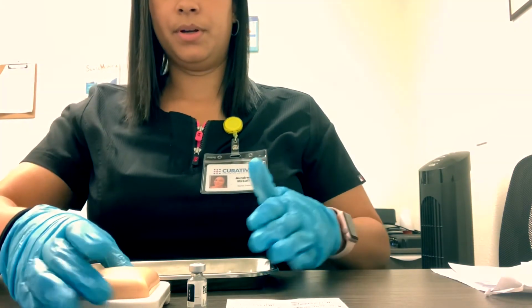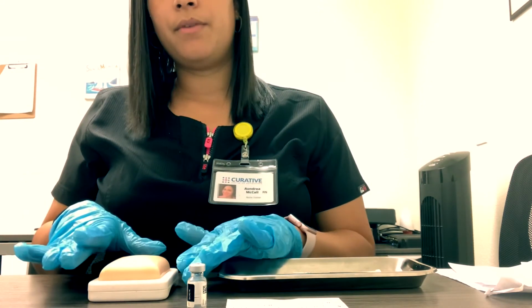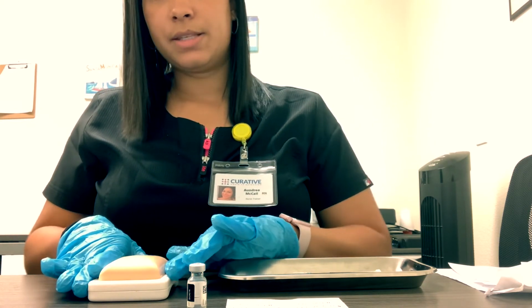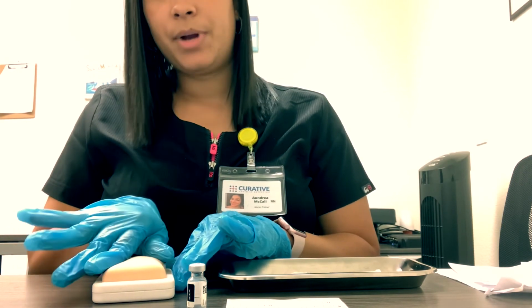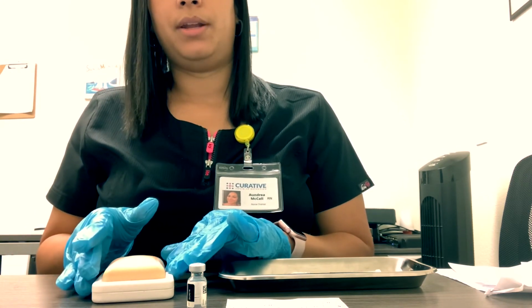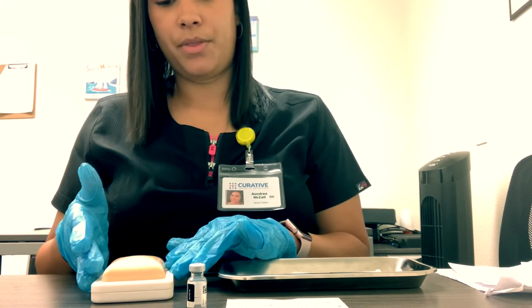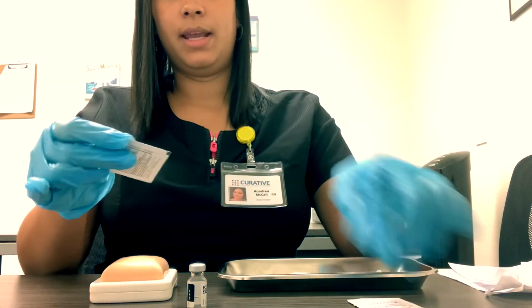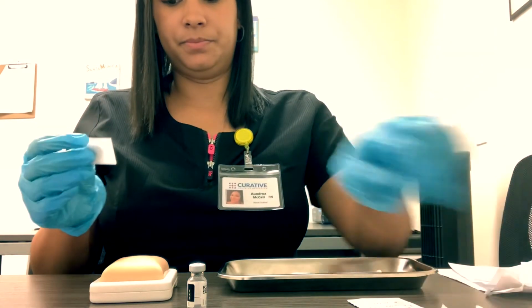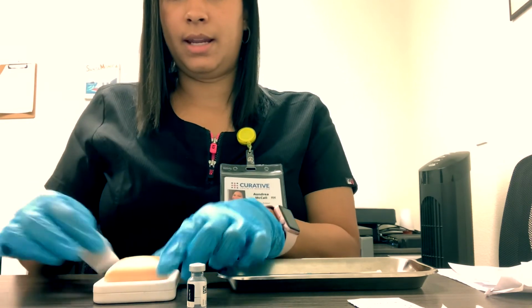Now we're going to go ahead and prepare to vaccinate our patients. And when we are vaccinating our patients, you guys need to use your best nursing judgment as to which technique you're going to use, whether it's the Z-track, whether you're going to pinch or you're going to spread the skin. We just want to make sure that we are going IM. Reason being, if we go sub-Q, then our patients can end up with a huge welt on their arm about a week after getting vaccinated. So we're going to go ahead and clean our patient's skin in a circular motion from inner to outer and let it air dry.